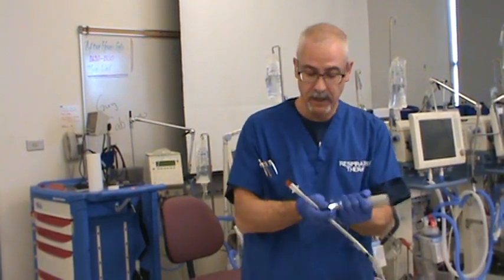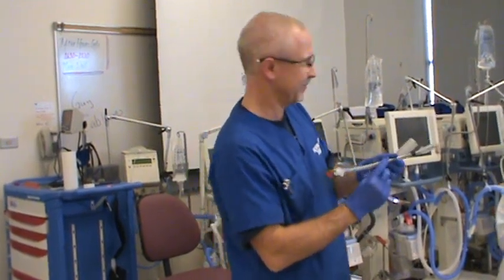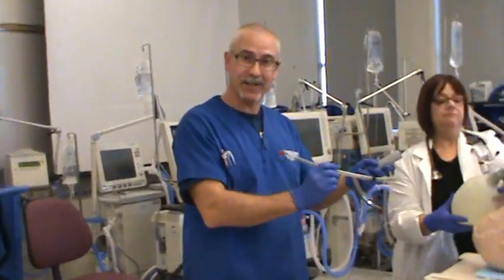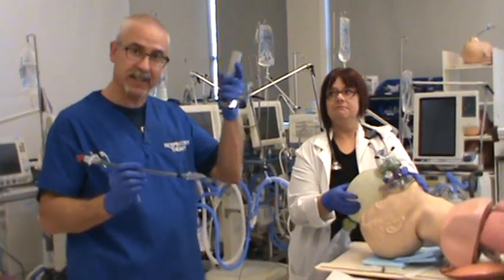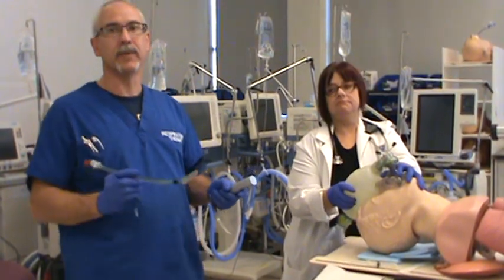At this point in time the light's still good, so let's intubate the patient. Remember: hyperoxygenate and ventilate. We've already suctioned out the airway, we've already anesthetized the airway, now we're going to put the tube into the patient.